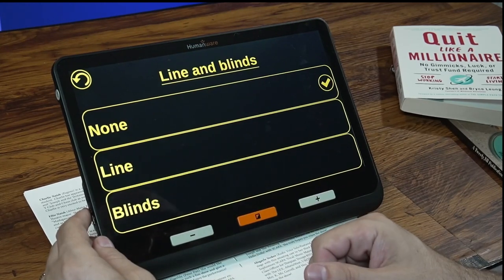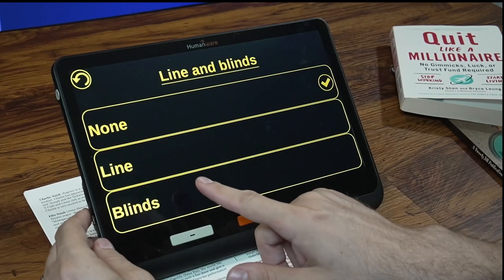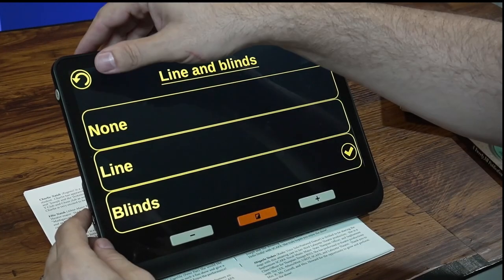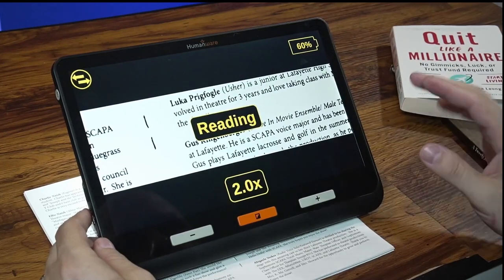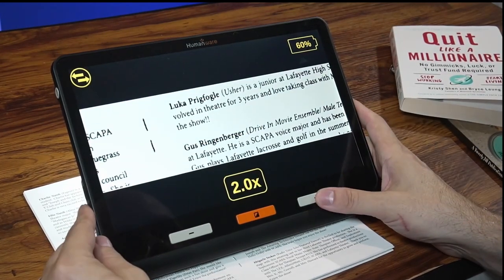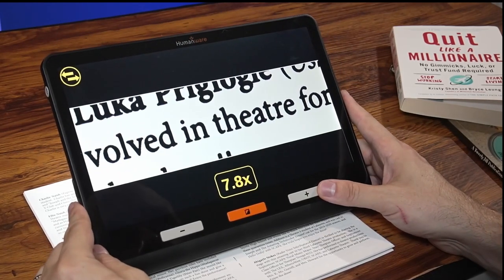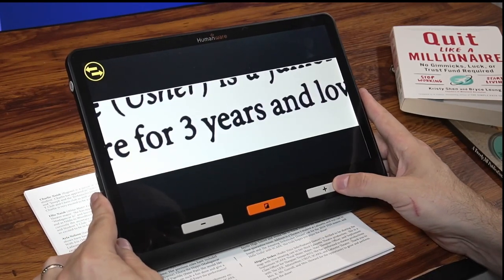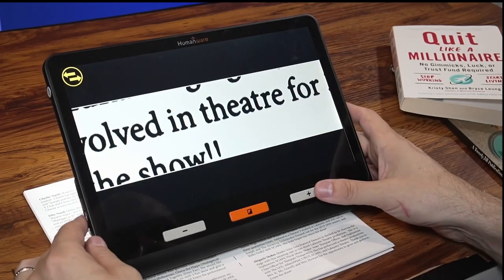Also in the menu, there are lines and blinds features. This puts either a horizontal line or a horizontal blind on your screen. When zoomed in, this lets you isolate certain lines of text, making it easier for some people to follow along and read.